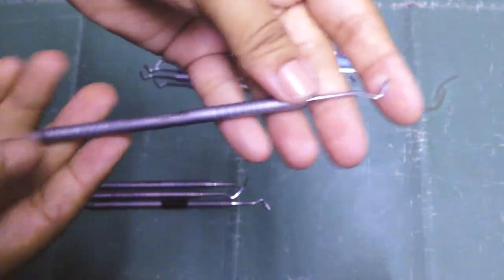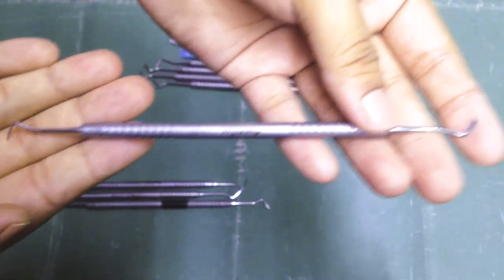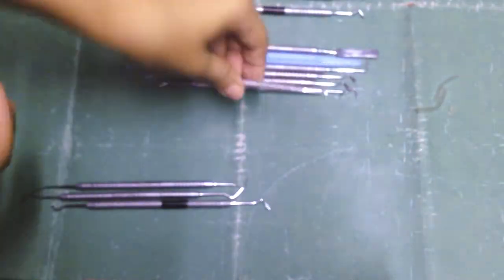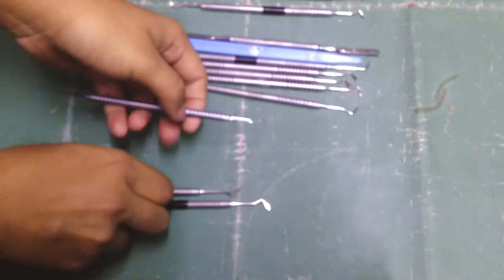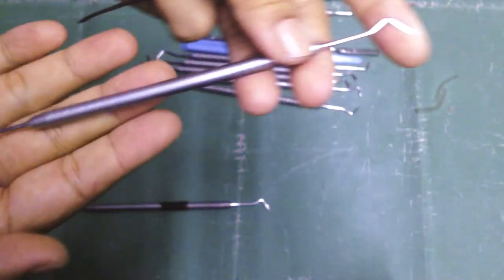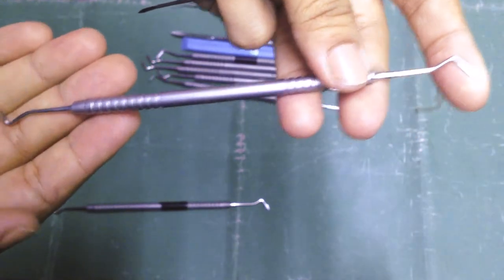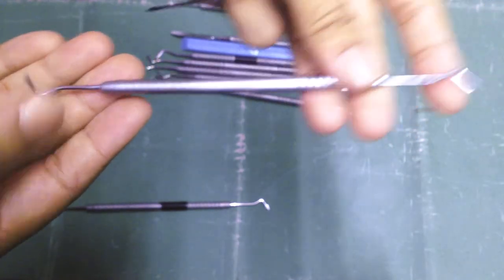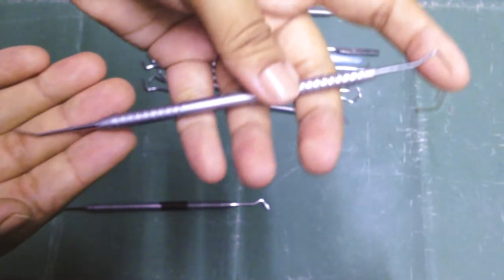Let's start with this one. This is a Hollenback carver. Then here, let's take both of these. This is a Walls carver, and this is a Ward's carver.